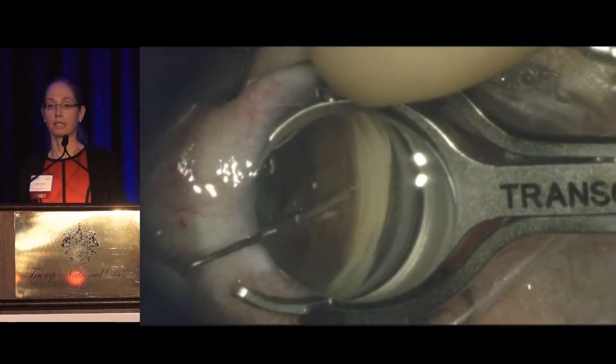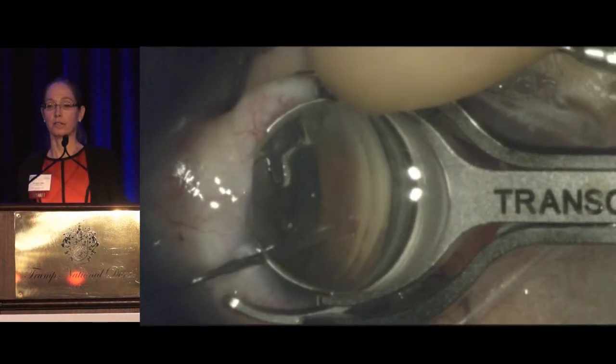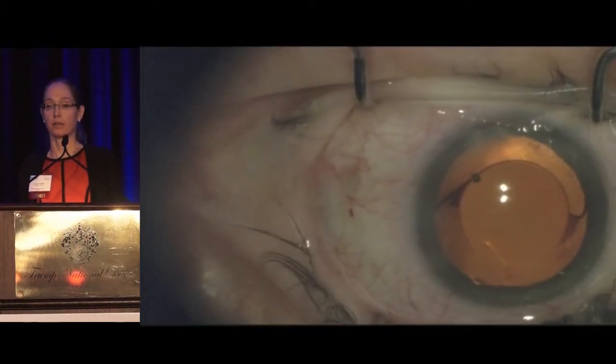And here you'll see I release the stent. I sort of tap it into place. And you'll see in a second a little bit of heme reflux, which is normal and actually indicates that it's probably well placed. And then you finish your cataract procedure.